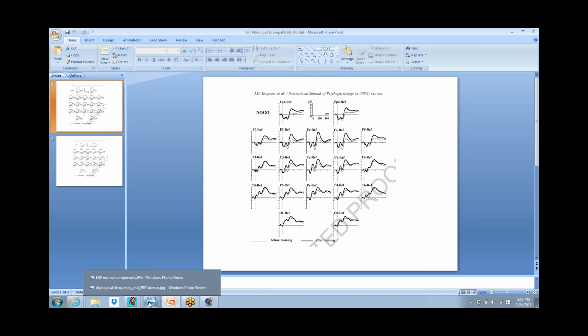The EEG is full of ERPs. They're hard to see, but they're there. And the ERP, if it's handled right, doesn't have EEG in it. That's a big difference. The EEG averages out. You basically see ERP only at 100 repetitions.